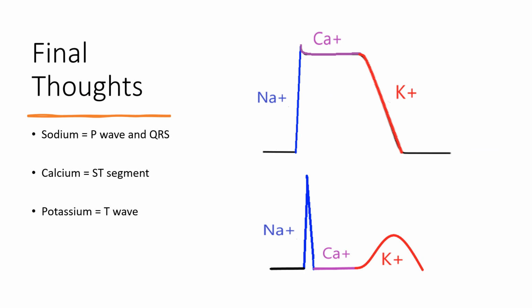All right, so I lied and said that this was going to be quick, and then 25 minutes later, we're still talking about this. So just a recap all the way to the back. The part that you wanted from this: when I'm looking at an EKG, how can I use the EKG to identify major electrolyte changes? And so we're just closing with that.